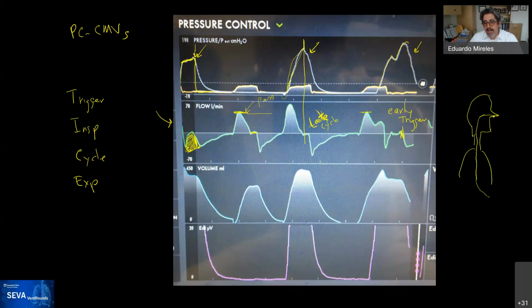It's a special type of catheter with an area where you can connect, and it has several sensors throughout. There's a formula to calculate where you're going to put it. The diaphragm goes through here like that.